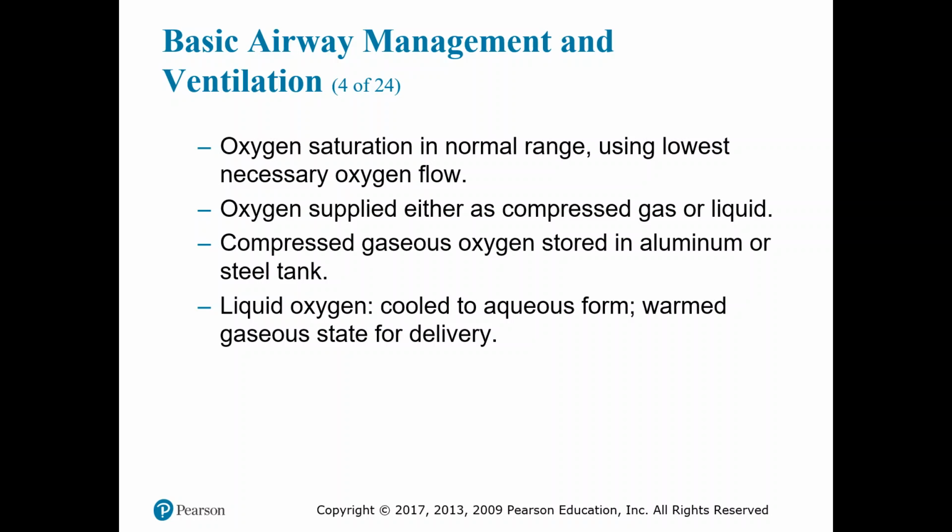Okay, as you can see here, oxygen saturation in normal range using the lowest necessary oxygen flow. We keep discussing this, and you're going to see this reinforced in the escalating airway algorithm videos that are on here. We always want to let the patient take care of themselves with the least amount of help as possible. We don't want to go overboard. We don't want to overtreat to the extent that it's harmful.